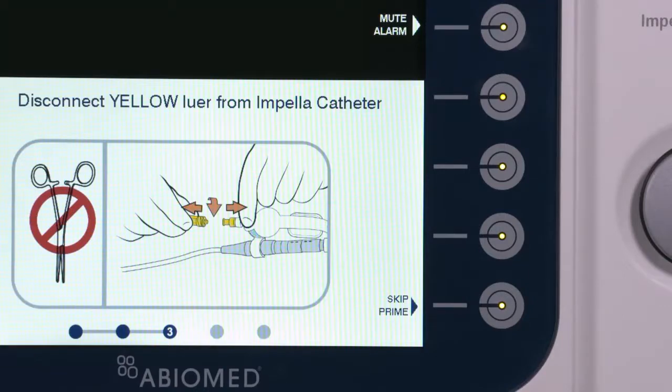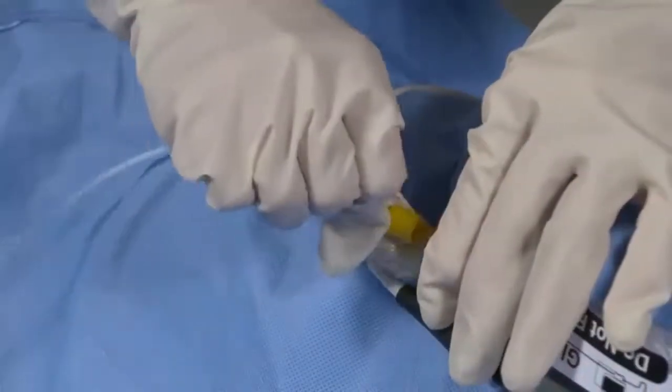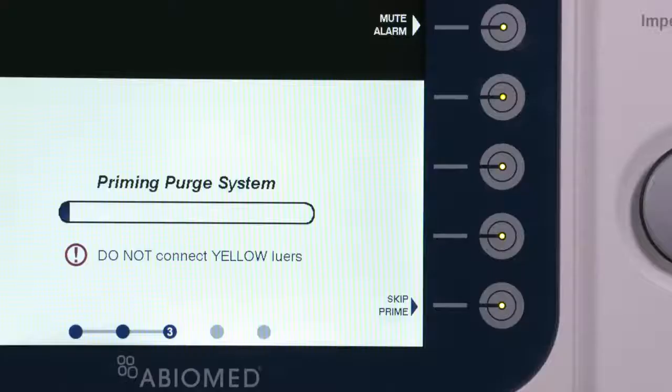To flush the Purge Fluid from the cassette, disconnect the yellow lure from the Impella catheter. Do not use a hemostat to disconnect the lure, as this could damage the Impella catheter. A blue progress bar will appear while the AIC primes the Purge tubing. Do not connect the yellow lure during this step.